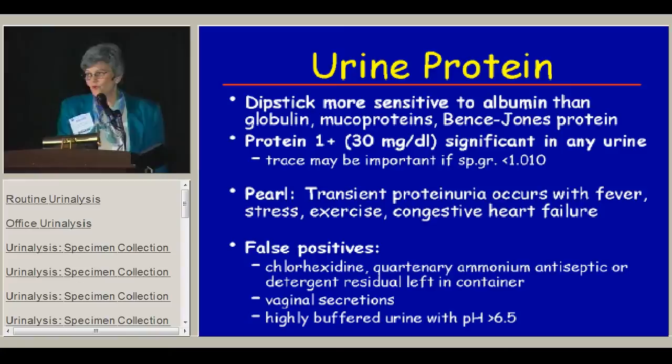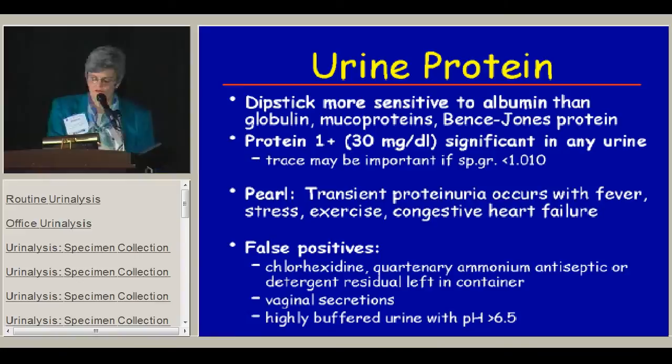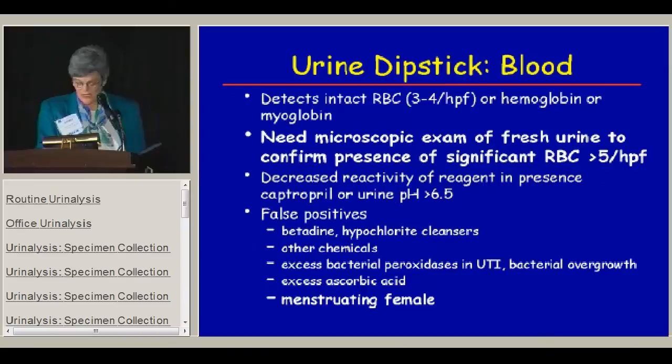There are a variety of things that can give a false positive for protein, including some antiseptics used to clean for clean-catch specimens. The most common problem we see in adolescent patients is vaginal or prostatic secretions in kids who don't clean off very well, which may give a higher protein than expected. Blood on the dipstick usually detects a very small amount of blood — three to four red cells per high-powered field — and it can also detect hemoglobin or myoglobin without intact red cells, so you need a microscopic exam to distinguish those things.